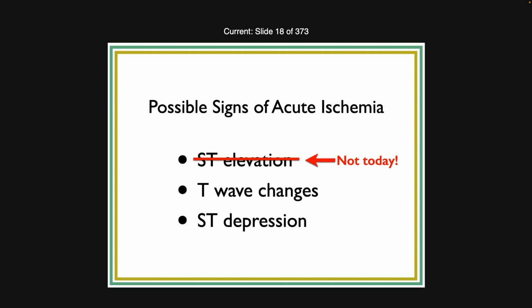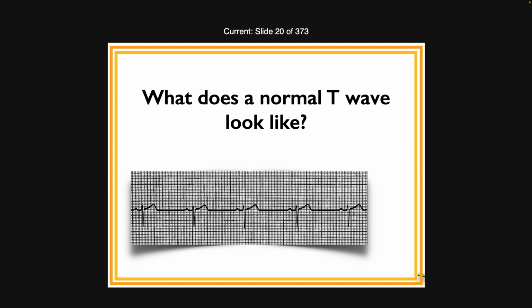But what we're going to be talking about, and it might take all day, we'll see how it goes, T-wave changes, okay? So, what have we learned about normal T waves? Let's say in lead 2. What does a normal T wave look like?